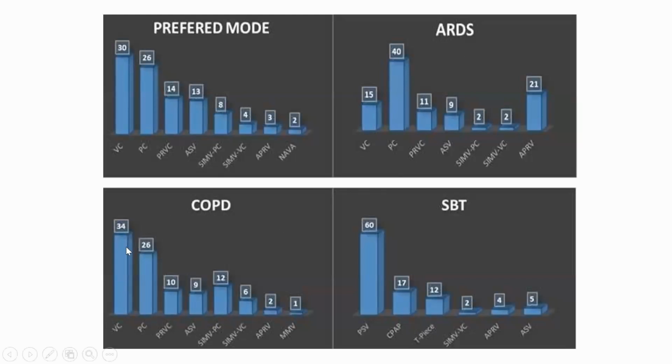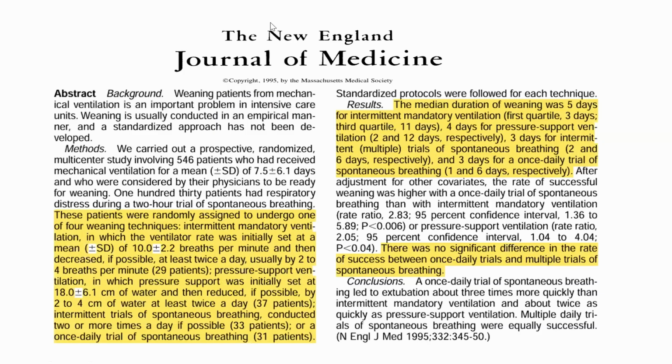For COPD, they are using volume control. So this is an international survey. Okay, it has included around 150, if I'm not mistaken, countries, and clinical experience also matters on the use and the choice of mode of ventilation.